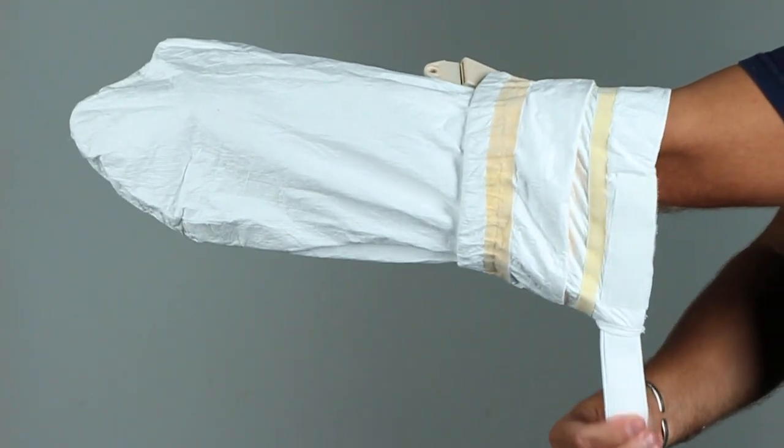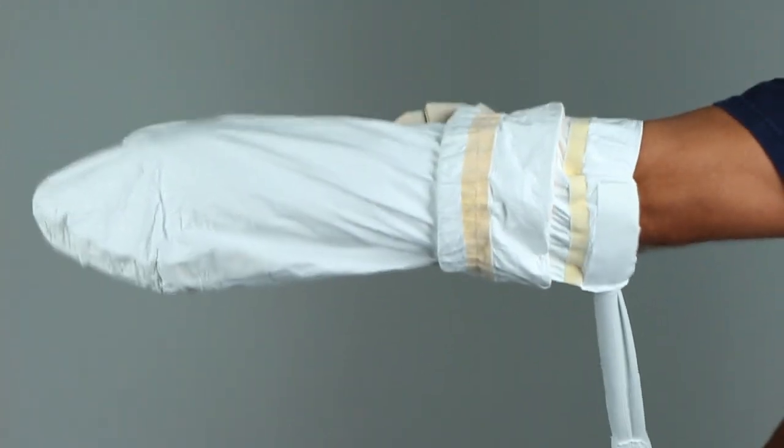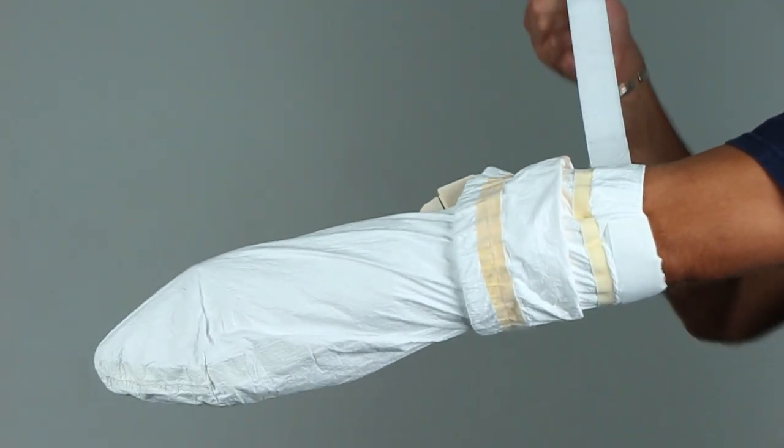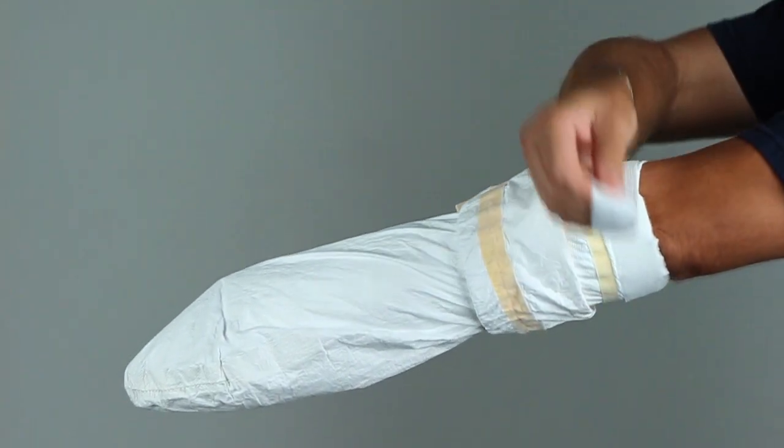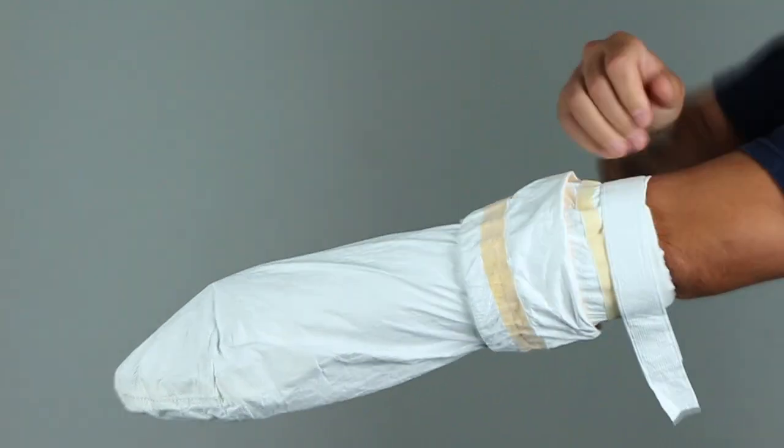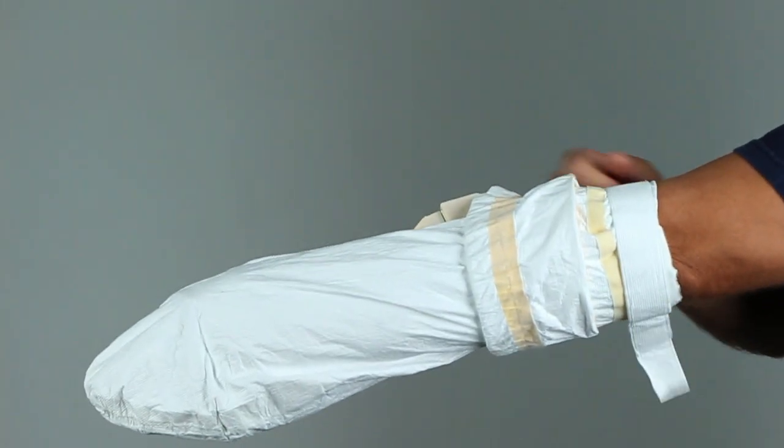Grasping the loose end of the white Velcro strap, wrap it around the cast cover and affix it to the other end. It should be tight enough to fit snugly against your skin right above your cast or bandage, but not tight enough to cause any pain or discomfort.